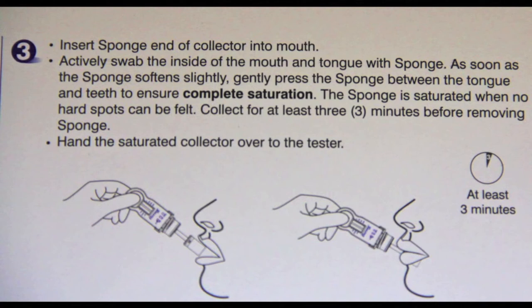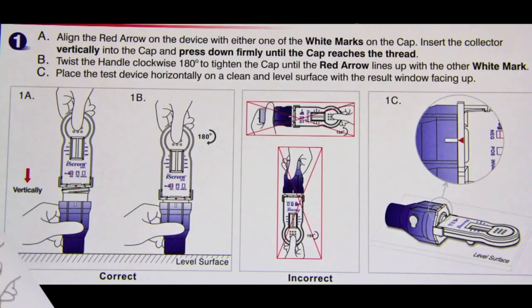Afterwards, the user should hand the saturated collector over to the tester. Then align the red arrow on the device with either one of the white marks on the cap.